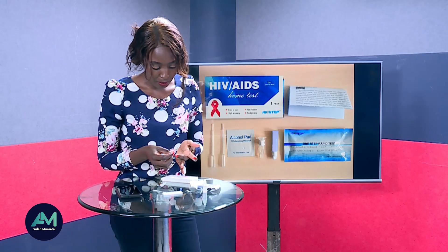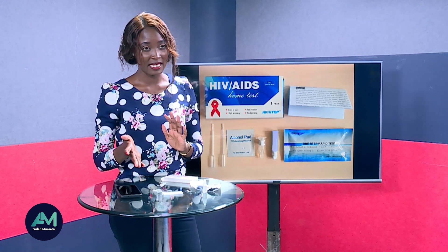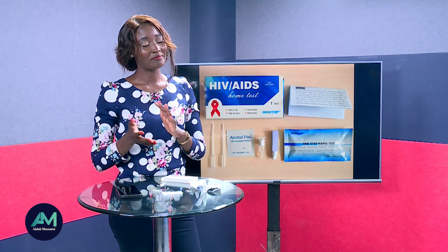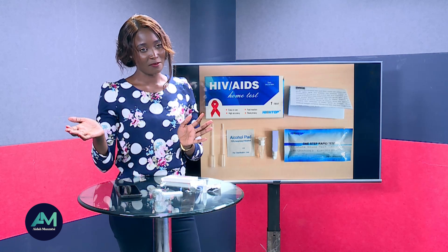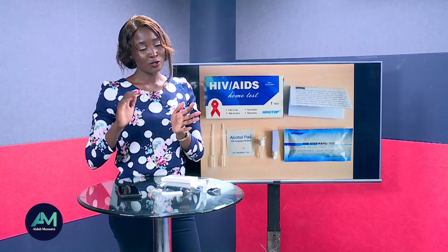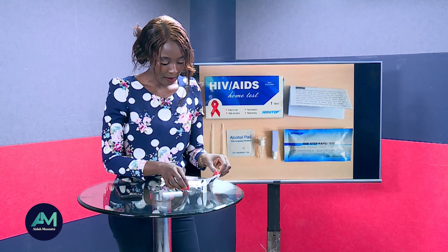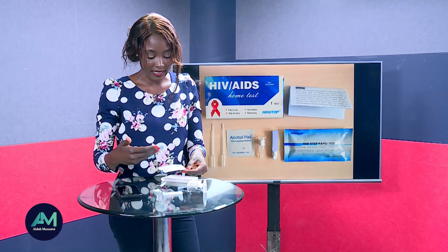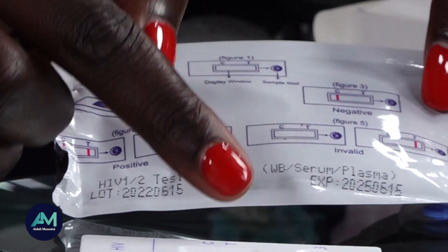My blood has stopped coming out. The test normally takes between 15 to 20 minutes. You should not read your results before 15 minutes, and you should not read them after 20 minutes — read within that 15 to 20 minute window. The results have actually started showing. There is a place marked C and a place marked T on the test.